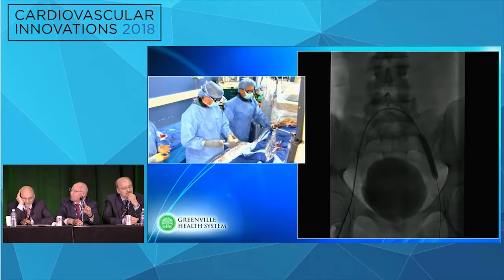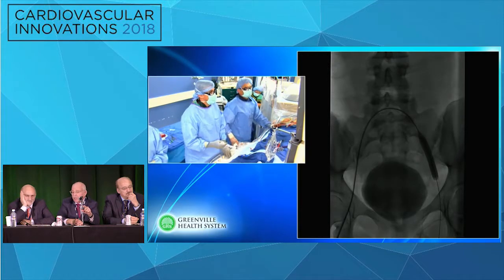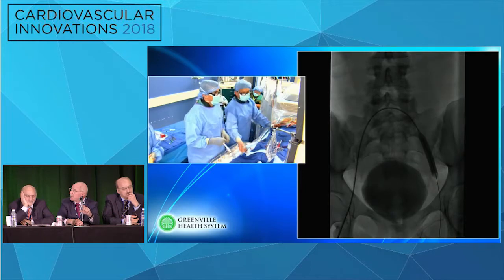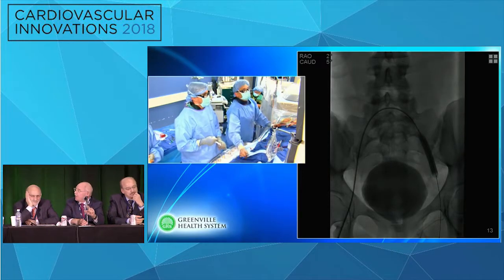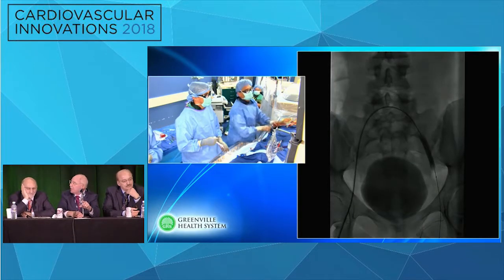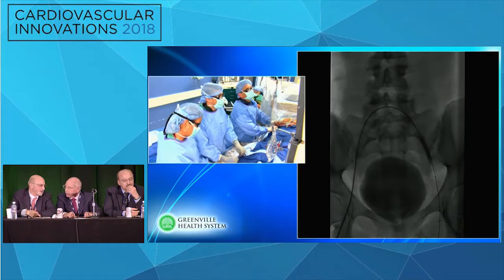Otherwise, especially in a situation where you pick a fairly large wall stent, and then I might take an 18, but you're never sure where that's going to end up. So you have to know where you're going to place that ostial segment. And the only way you can do that is to come antegrade. That's the point. So, excellent. Thank you for clarifying that.